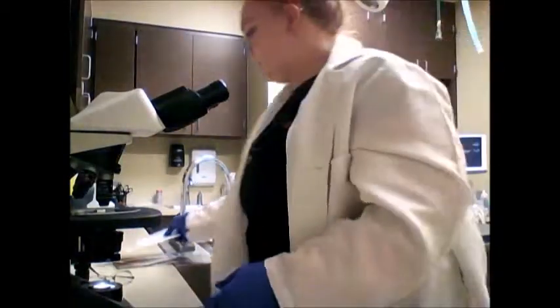So now we know where she's at, and that's actually really great that it doesn't seem like she's anywhere near starting her period. It makes it a little bit more difficult when you're spaying them, but we don't have to worry about that with her, so that's awesome.